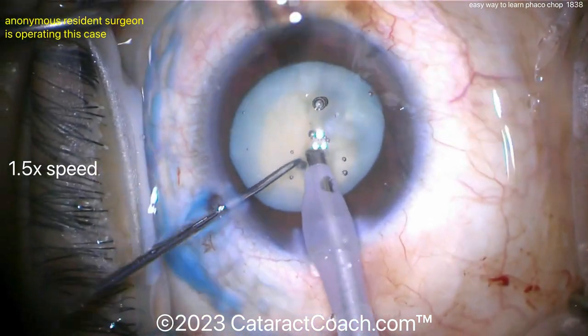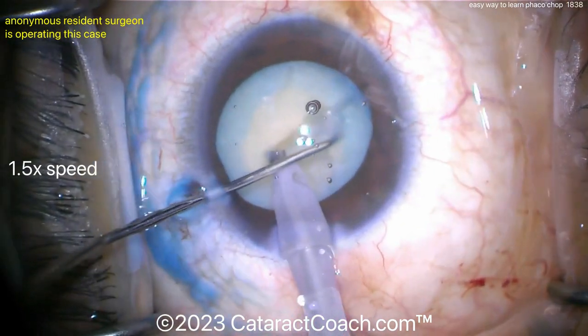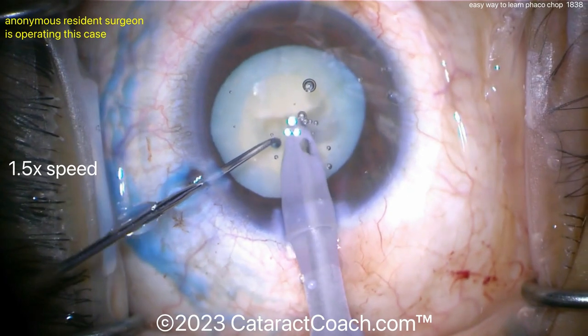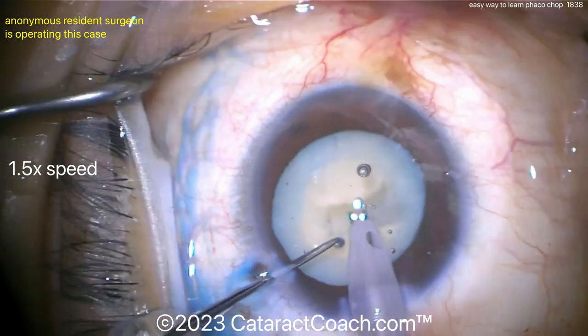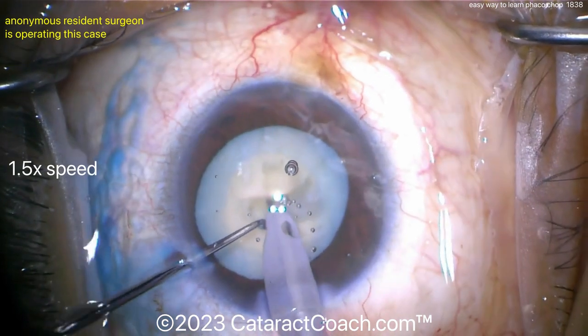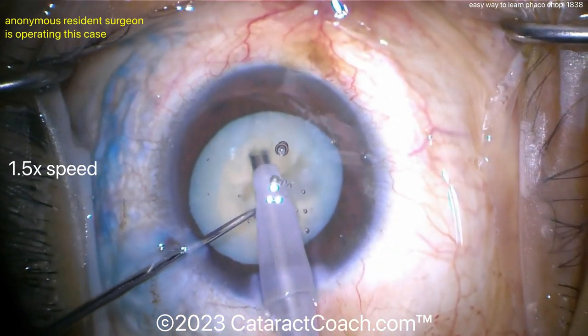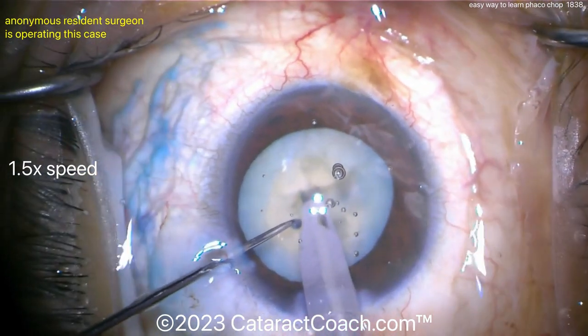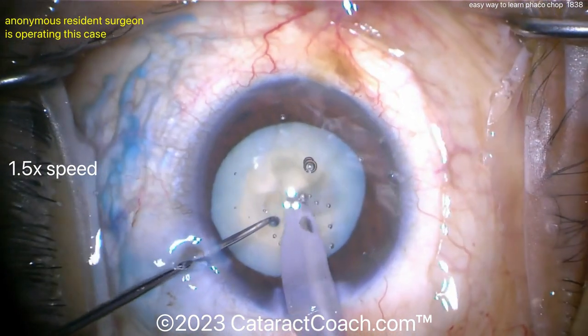Bring the pieces up. Are we chopping or grooving? Grooving again — so this will be a full four-quadrant. Get four complete quadrants, and then as the pieces are brought up, chop each quarter into two eighths. That will allow you to do four chops for this case, and it will be very satisfying.